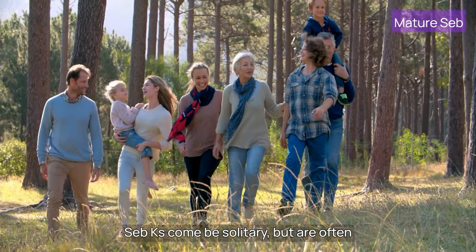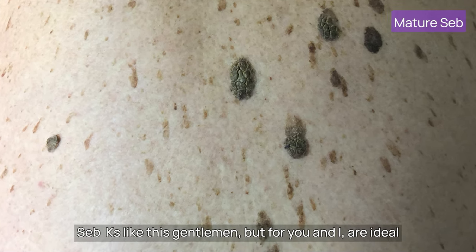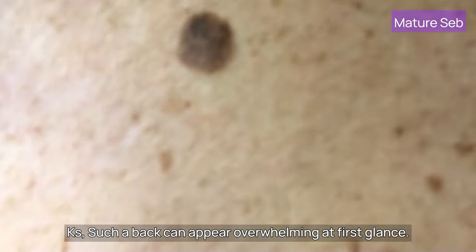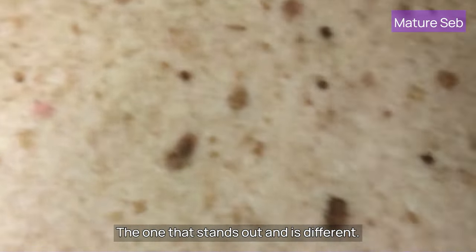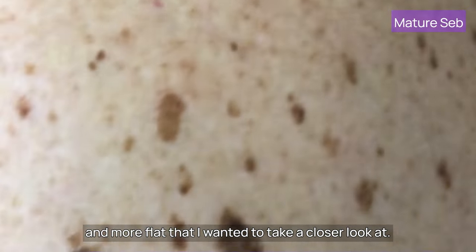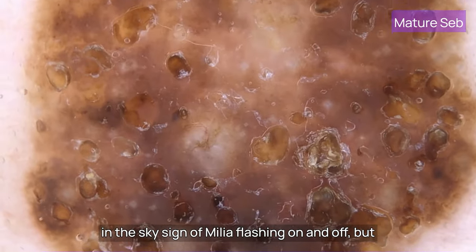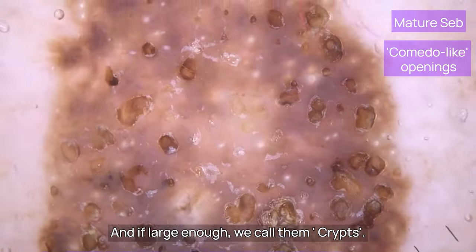Seb Ks can be solitary but are often in families of all ages, sizes and colours. Some unfortunate patients have many hundreds of Seb Ks — for you and I, ideal learning ground to look at Seb Ks of different ages and types. This gentleman has quite a few hyperkeratotic Seb Ks; such a back can appear overwhelming at first glance. How do you pick up a melanoma amongst this lot? You're looking for the ugly duckling — the one that stands out and is different. In this gentleman I found one that was darker and more flat that I wanted to take a closer look at.